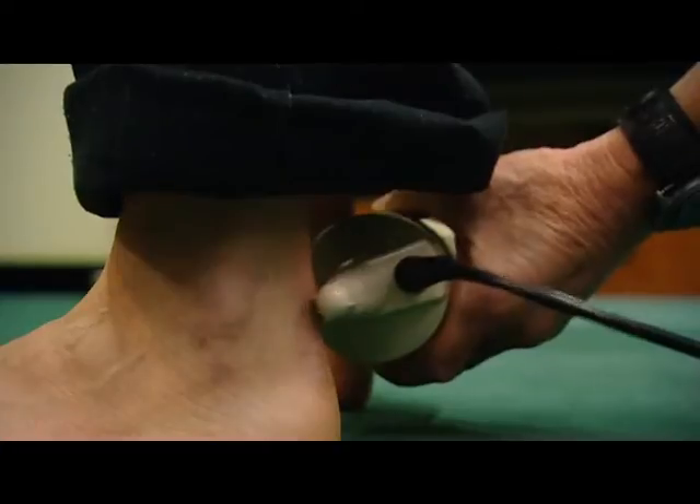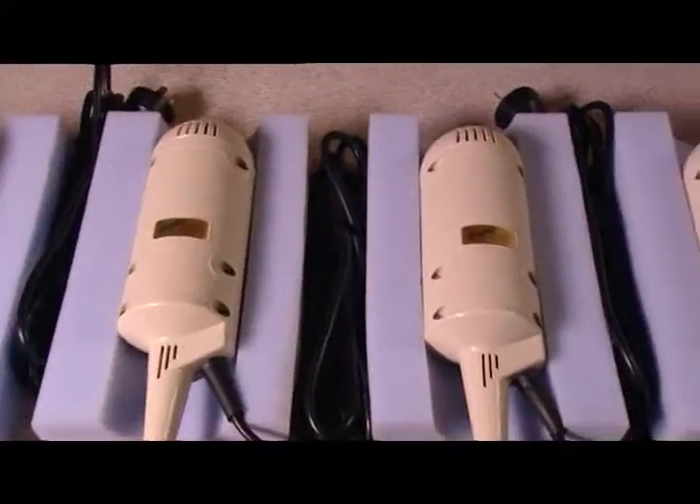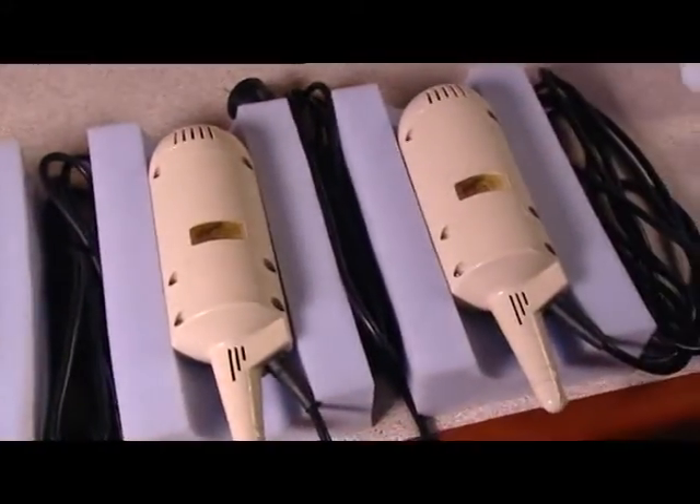They're very well made — solid plastic — and despite repeated droppings on the floor, we've managed to get them to last about 18 years. We've found the reliability and robustness to be really good, and we're very happy with the quality and life of them. We're happy to buy more and continue using them.